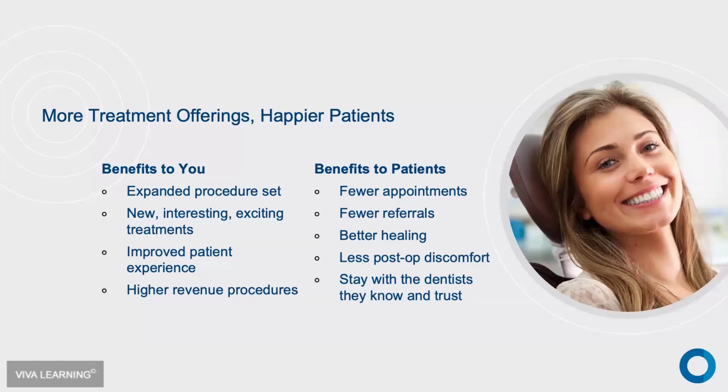And that's the benefit to you. This is new stuff. It's different. It kind of invigorates the day, but the benefit to the patient, I'll give you one example with crown lengthening. Normally, at least what I was taught is you want to give it at least 6 to 8 weeks of healing. And with this, basically, I'll show you a case where we basically went to the final restoration in one day.